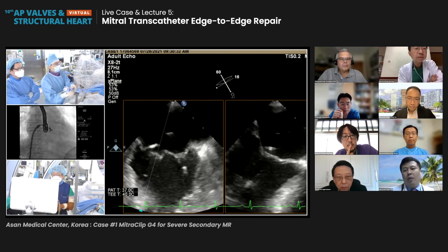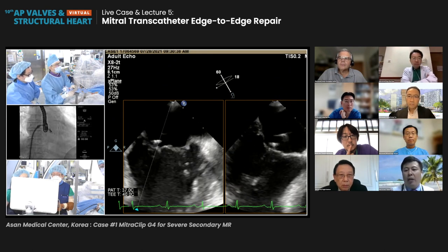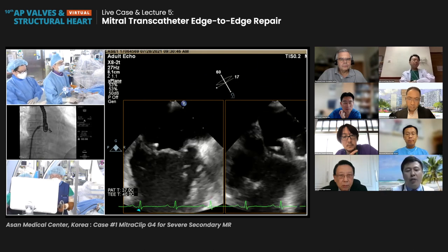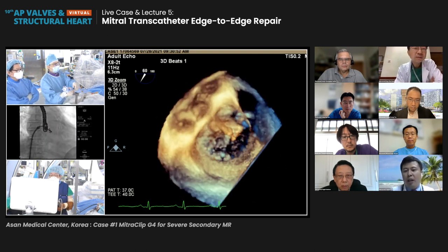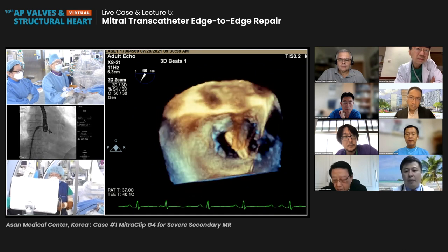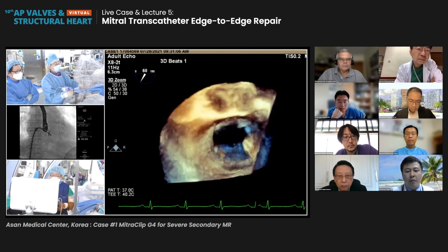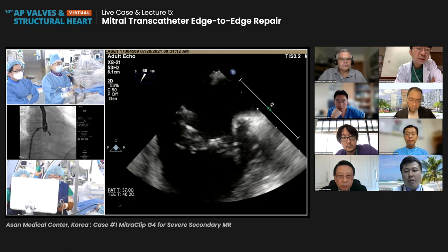Yeah, I would like to move a little bit medial and lateral and then check the trajectory. And then move to the medial right side. Do you want to check the orientation again? It's important. And then we can use the multiple view to see whether the clip is oriented anteriorly directed. Please locate more medially. To posteriorly. Okay. Let's move to 2D image again.